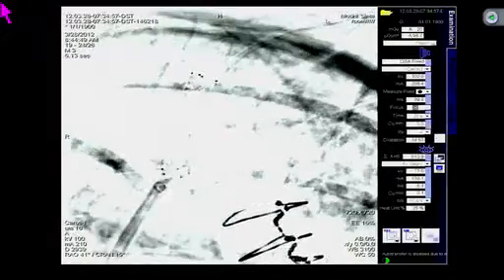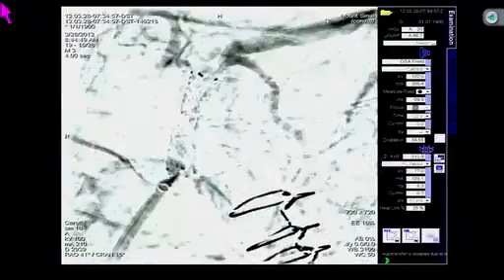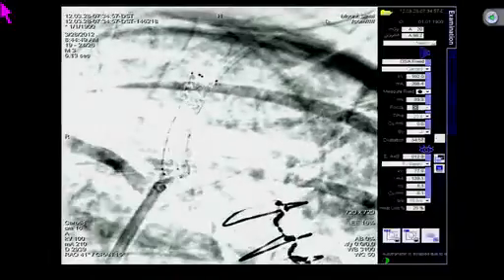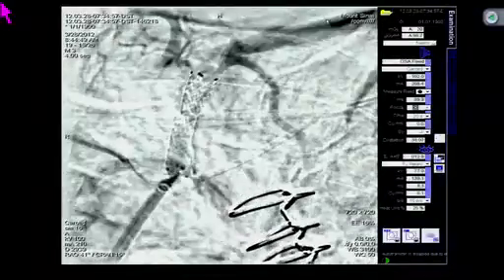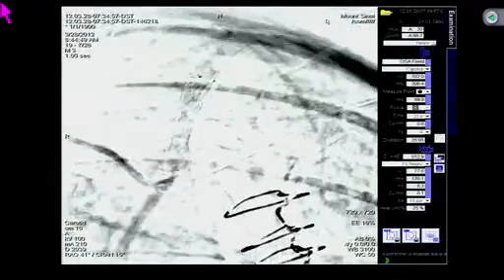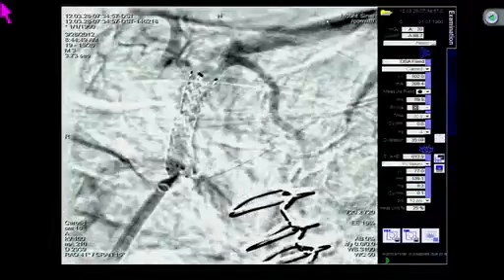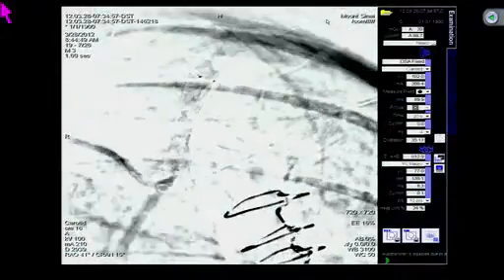Yeah, you have an excellent, beautiful balloon expandable stent. You know, in this view, I actually wouldn't even post dilate. We have no real pinch to that vert, and I think it's more a little bit of nothing, just an angle. And the LIMA is very, very robust. So, I mean, I'll check a gradient as we talked, and I've got dual transducers now. We're going to zero both in a second. Let me just do this.